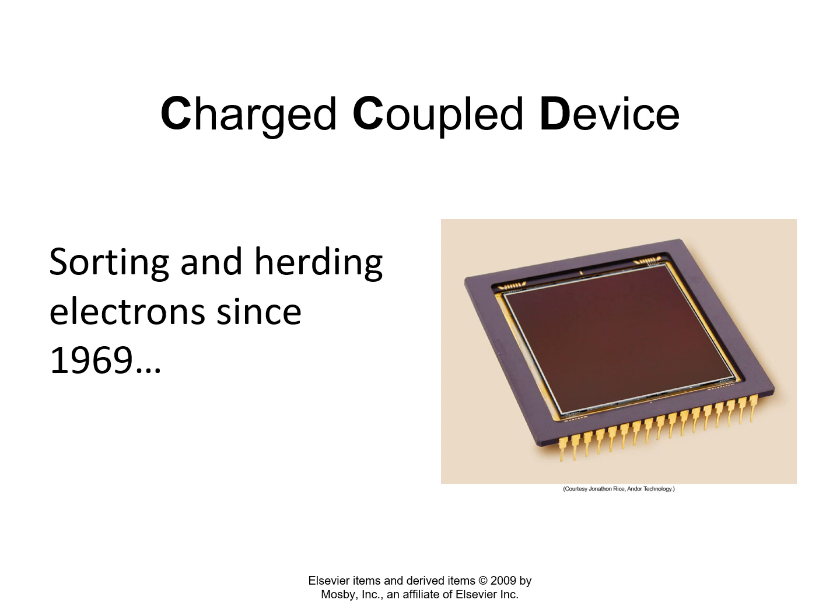So charged coupled device. 1969 is when they figured out how to make silicon, pure silicon, able to catch light photons and create a voltage across the silicon wafer. It's called the photovoltaic effect. It's how solar panels are made. But what they figured out is they could make a solar panel that understood what light it was capturing.